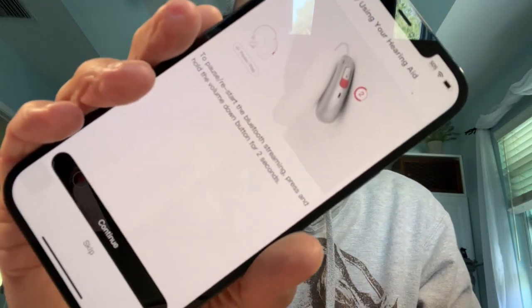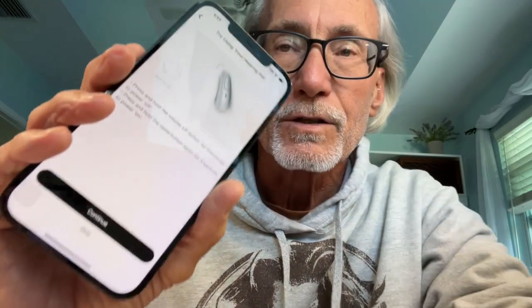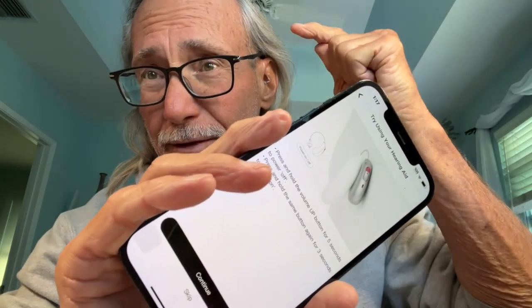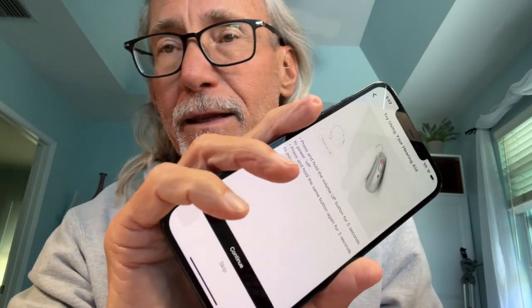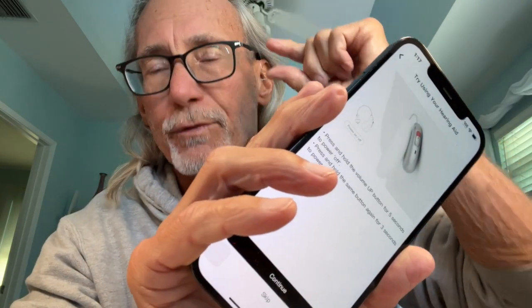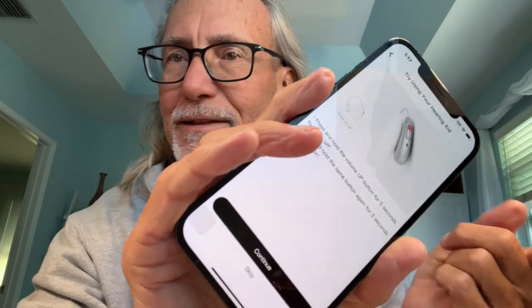So it says here, to pause or restart the Bluetooth streaming, press and hold the volume down button for 2 seconds. Okay? All right, so we get that. Press and hold the volume up button for 5 seconds to power it off. So to turn them off, you have to hold the top part of the button for 5 seconds, and that will turn them off. Press and hold the same button again for 3 seconds to power them on. So the top of the button, you're going to press for 5 seconds to turn them off, 3 seconds to turn them on. Okay? Got it? All right, let's continue.